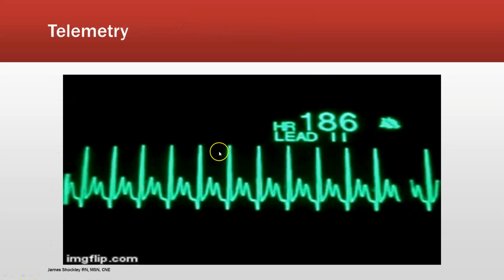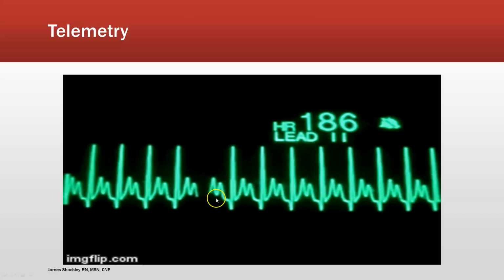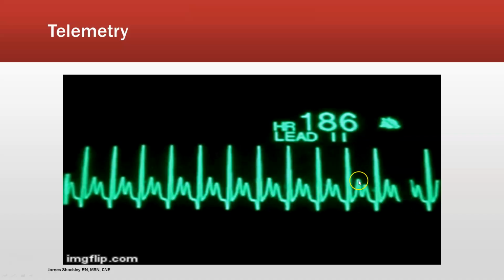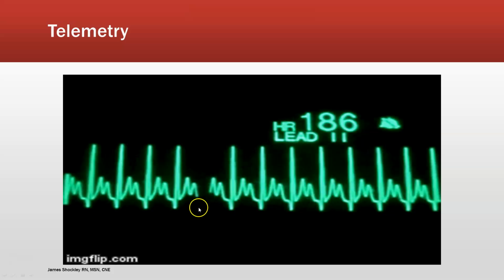And here's kind of what it looks like. Now, on this particular one, you do see that the T wave at least attempts to come back down to that isoelectric line. But then we do see that we have this P wave, probably a very large P wave. So I don't know, maybe they have some sort of atrial enlargement or something as well.